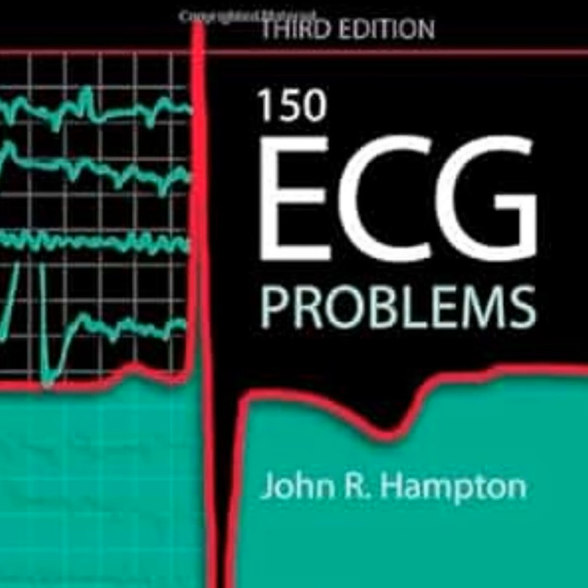And that U wave is generally thought to represent the delayed repolarization of the Purkinje fibers. It is just incredible to think that you are visually observing the altered kinetic flow of ions on a piece of graph paper. It really is. And this interplay between systemic chemistry and electrical function becomes literally deadly in case 117 from the book.